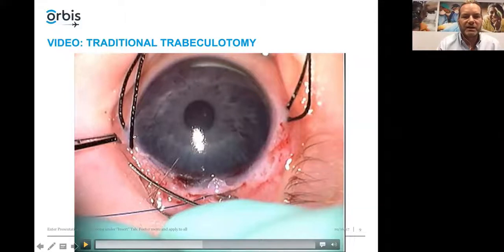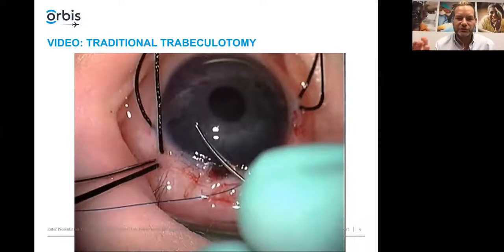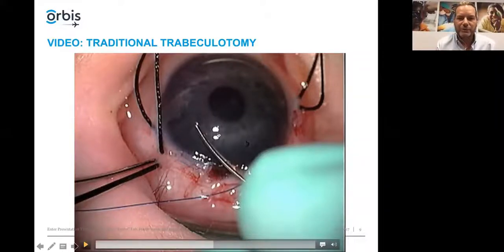Sometimes if you slide it in all the way though, that puts the trabeculotome all the way over here and there's just too much tissue or it's not curved enough. So a lot of times if it won't rotate in easily parallel to the iris plane, you have to just back it out a little bit and then rotate it in. So you're probably getting 1.5 to 2 clock hours in each direction. And when you rotate that, I kind of stop about where this one's rotated, or maybe a little bit more.